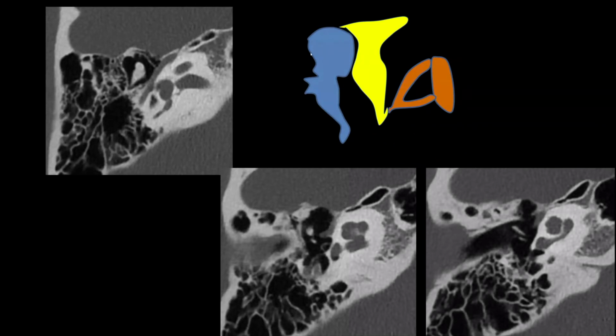So if we take an axial CT image up here superiorly, we're going to see that nice ice cream cone configuration of the two ossicles, with the malleus head forming the ice cream, and then the body and short process of the incus forming that nice cone. And then as we scroll down, you're going to be seeing the manubrium of the malleus and the long process of the incus. And so you always want to make sure you follow it down and see those dots coming down.